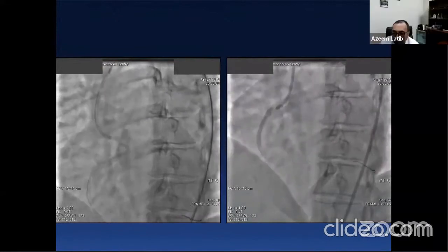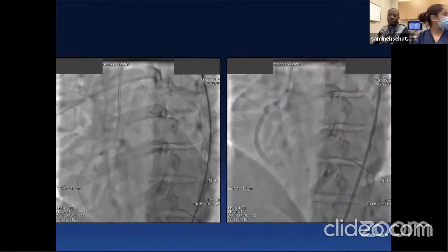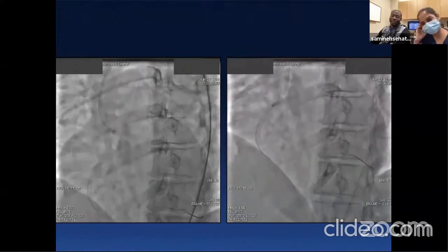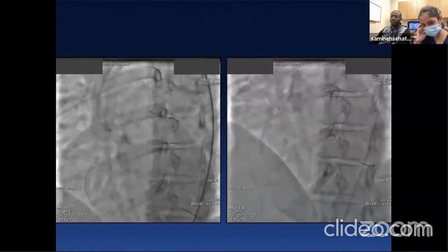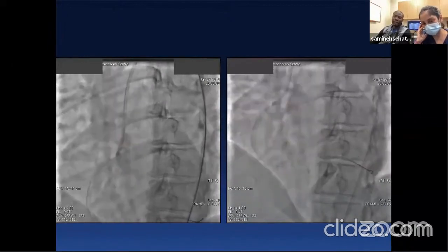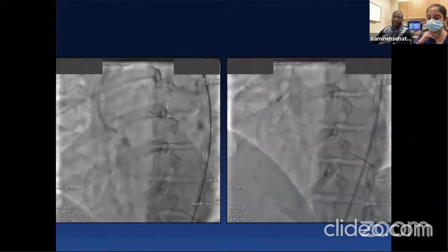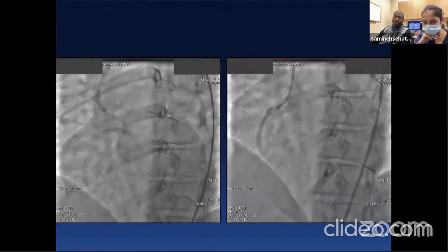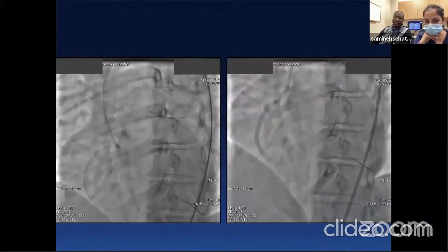Good. Thank you. Samina, Bob? Thank you, Dr. Ashok, for such a great talk. I'm still rewatching your calcified PCI talk. And then this one, I have a question about the sizing of these anomalous coronaries. Sometimes, angulation and sizing, they look indeed anomalous, as the name says. They don't seem to be the classic anatomical compared to RCA, left main, LAD, and almost look like grafts in some cases. What is your experience with sizing, stent size, pre and post dilating these lesions?